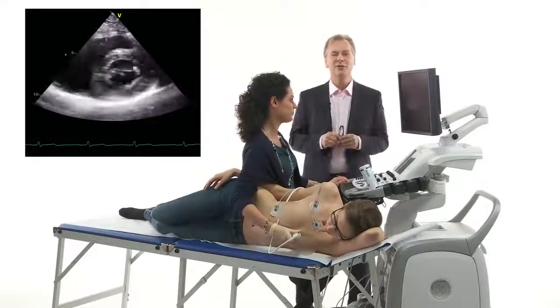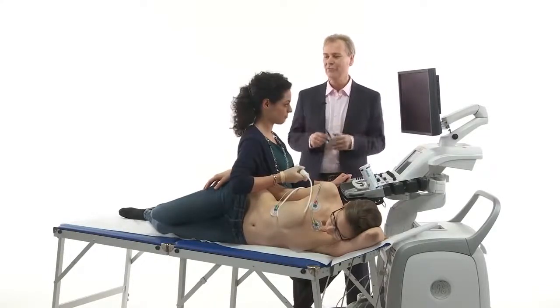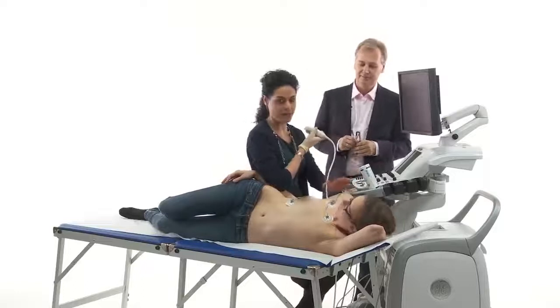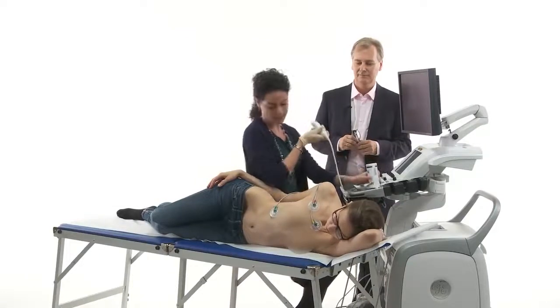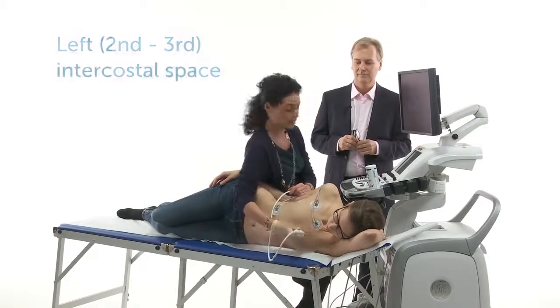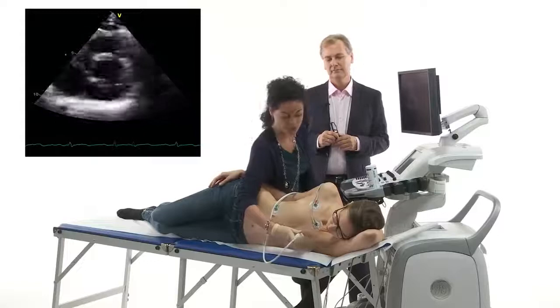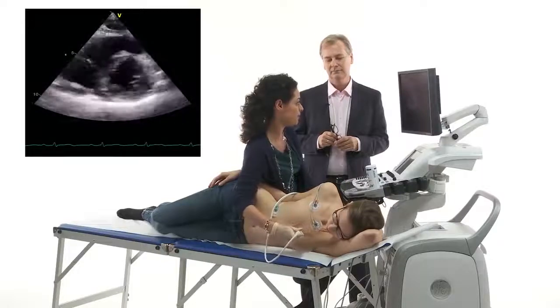We have to do this in slow motion, because you have to understand how we get this view. So Anna, can you just rewind and show us how you put the transducer and how to image? Of course. We usually have enough time to place our patient in the right position and use enough gel — it's the key to get a good image. The transducer for a parasternal approach has to be placed near the sternum, left part of the chest, and the transducer has a marker. This marker should point to the left shoulder of our patient. The position is around the second, third intercostal space. And here we are — we play a little bit and we have our image.